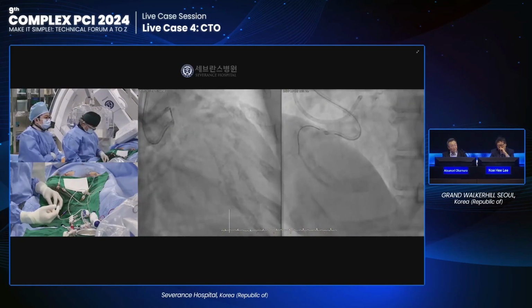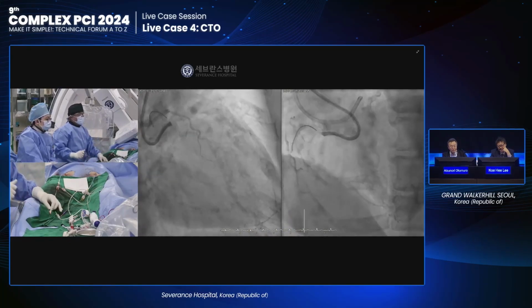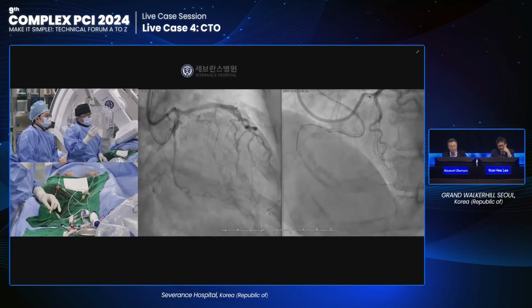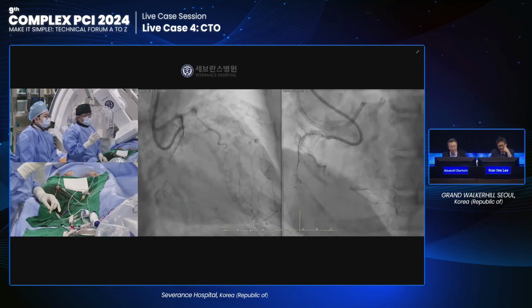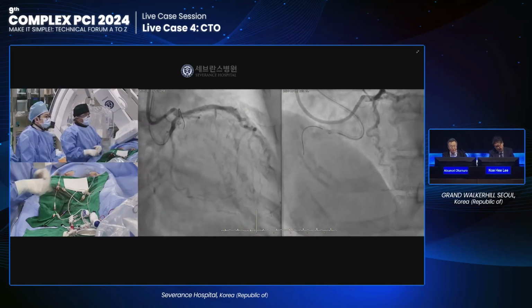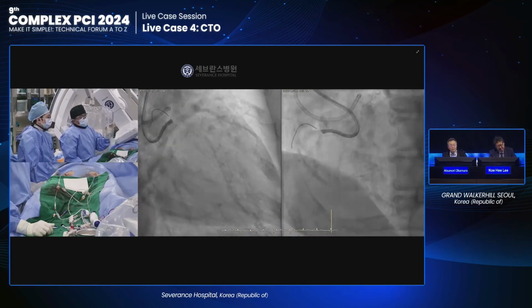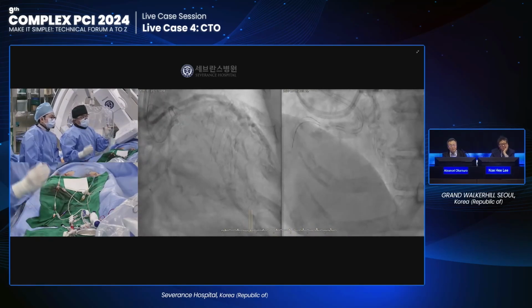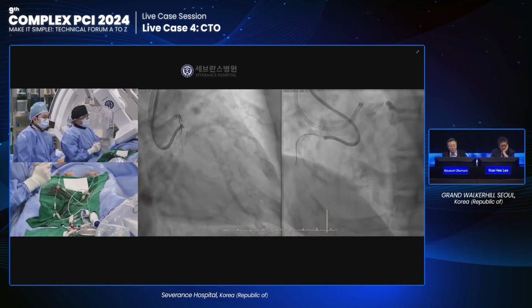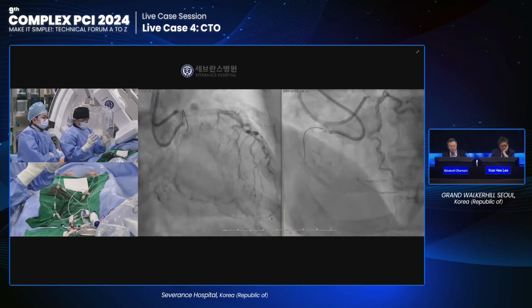Dr. Kim, I think you already did the selective angiogram. Previously Jong-Young and Ishihara told me, anyway, the problem is the limitation of the contrast volume. Initially I think there was no definite single collateral from the septal to RCA. And also we had some time, but the broadcasting is very limited.